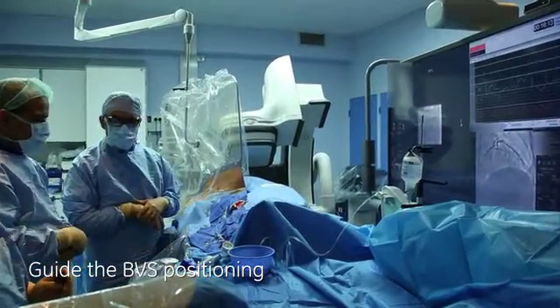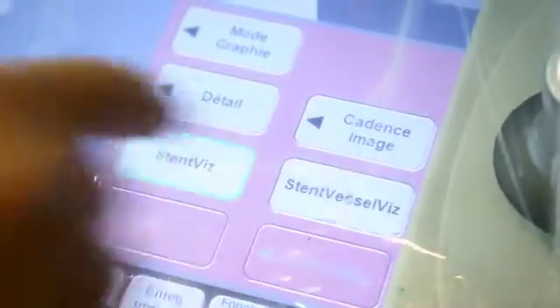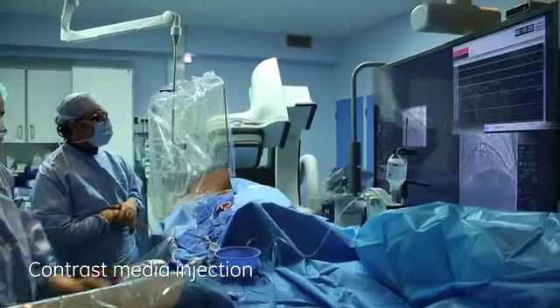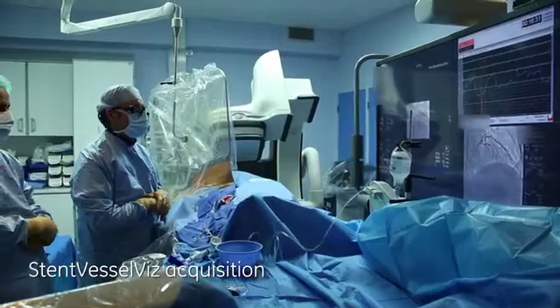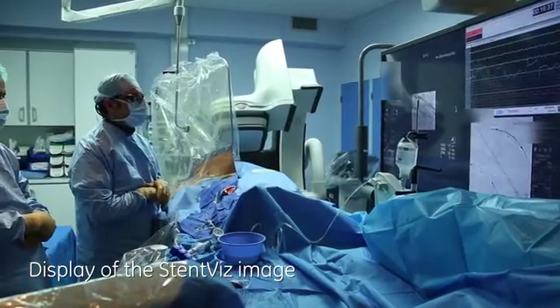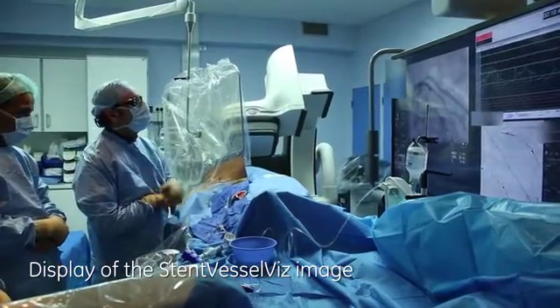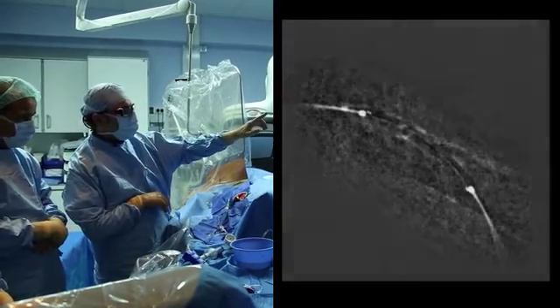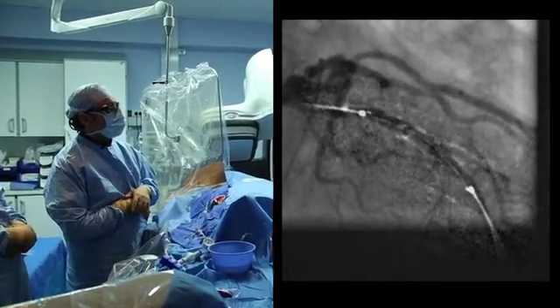For this goal it is very interesting to have this tool, stent vessel Vs. So it is very easy to do.